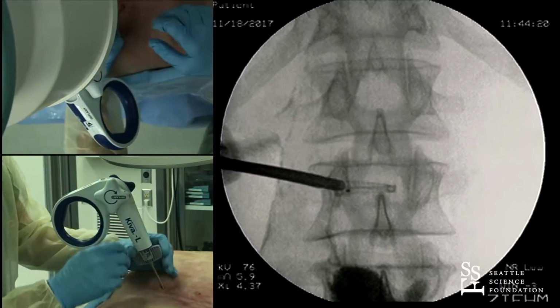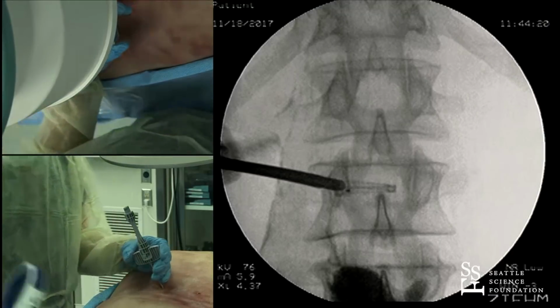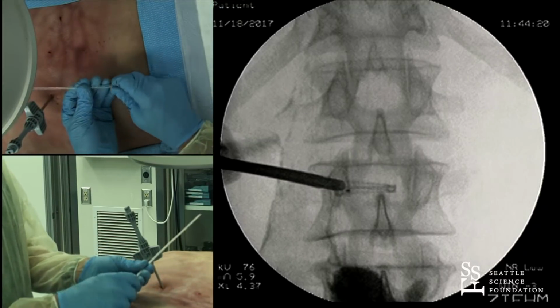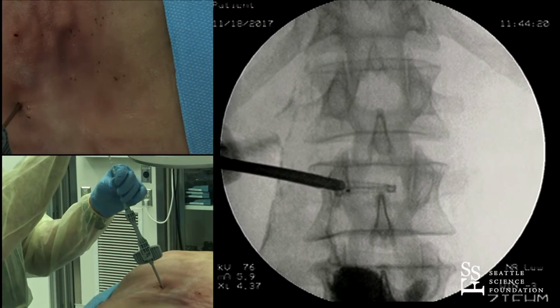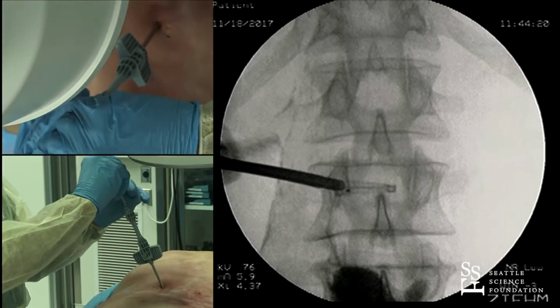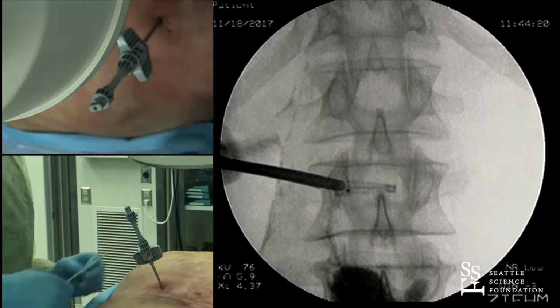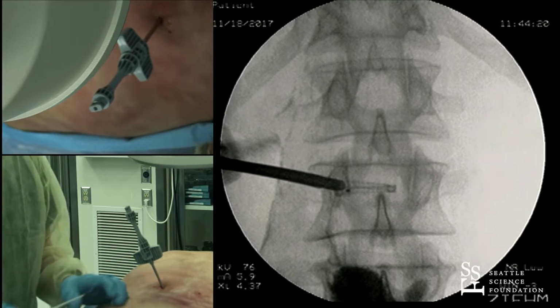Okay. Make sure everything's inside. We'll deploy the lever, move this, pull up on it. And for the cement distribution, we have this breakable tube that has a part that has cranial on it. So we could demonstrate that this is toward the outer portion. This goes down, and once we hit the distal tip, it will break off. It depends on how much you put in in terms of the length of the coil. The longer the coil, the less of this you break off.